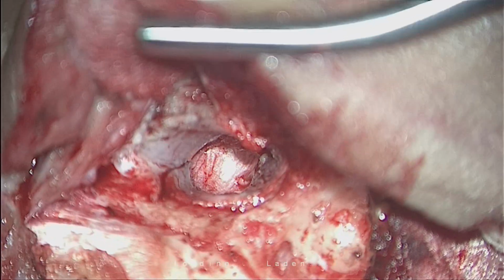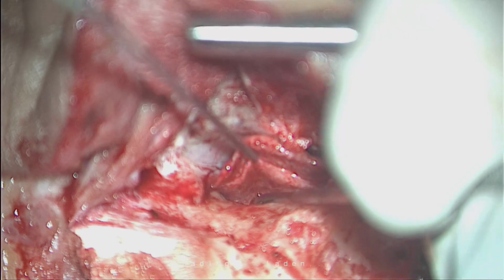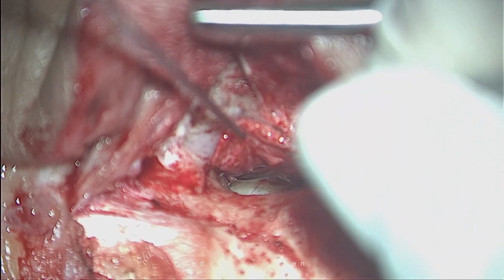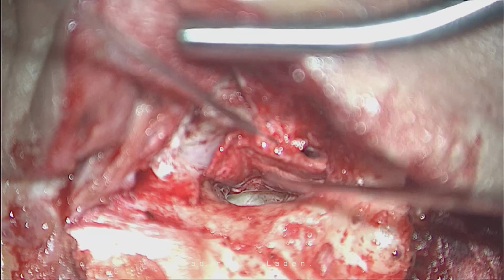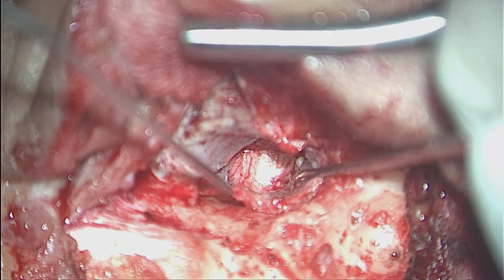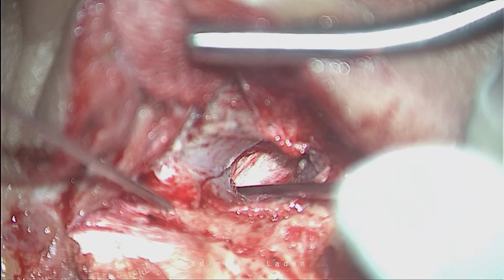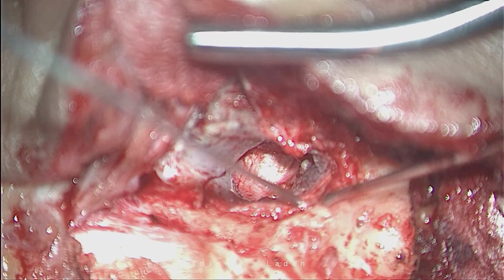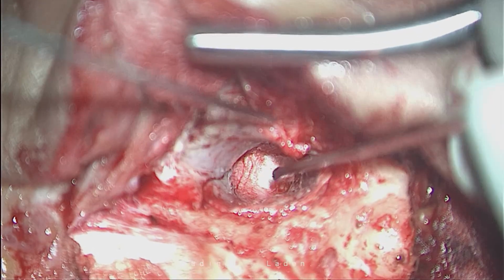And in this entire graft, you can again see the middle ear space very nicely. Nowhere in the middle ear is this needing any support. The support is all around at the periphery, you can see. Beautiful, Satish. So more and more support on the periphery keeps the graft in place.